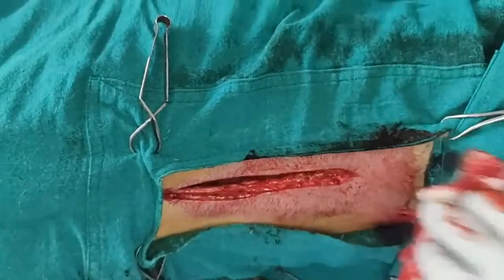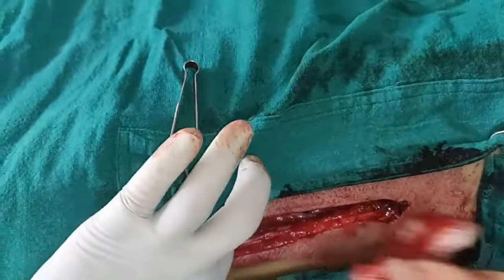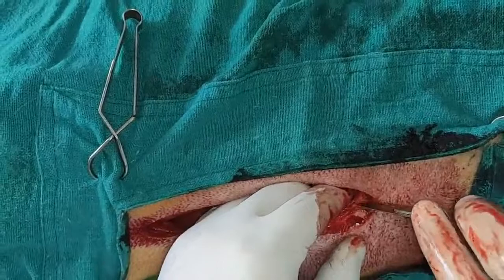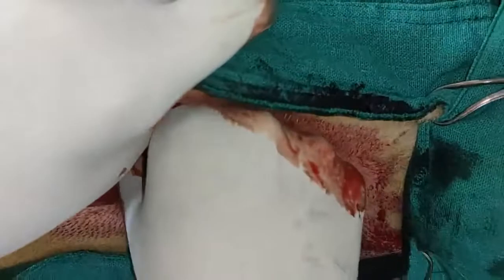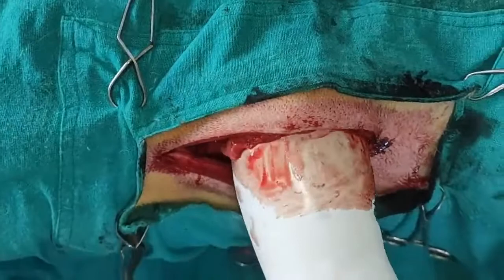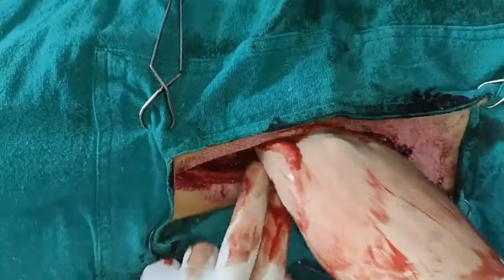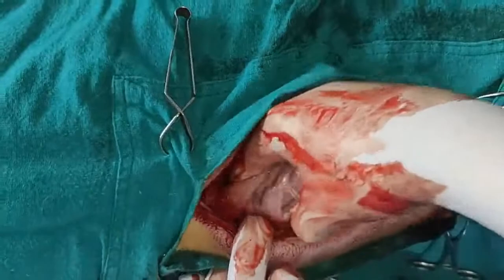We have performed the laparotomy and entered. You can see even the falciform fat is also reduced. Otherwise in such a breed it could be occupied up to this level. We don't have the Balfour abdominal retractor, otherwise that is very important for any abdominal surgery. You can see the distension of this intestine, so that could clearly indicate an obstruction. This is the kidney.